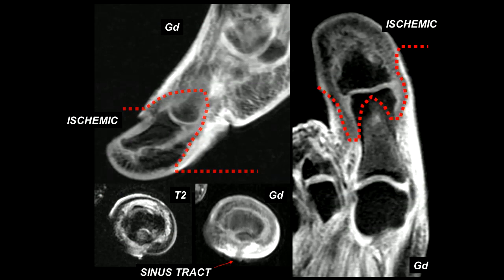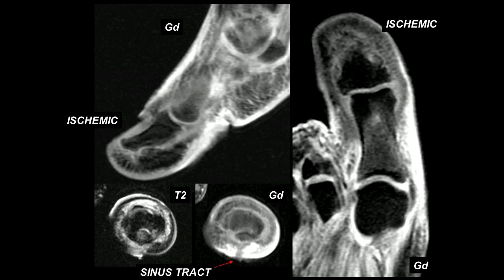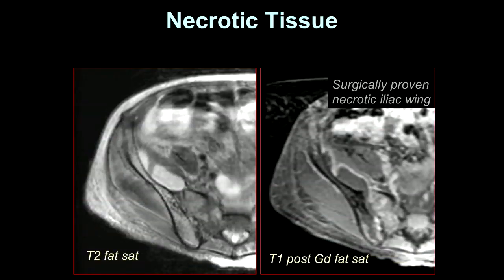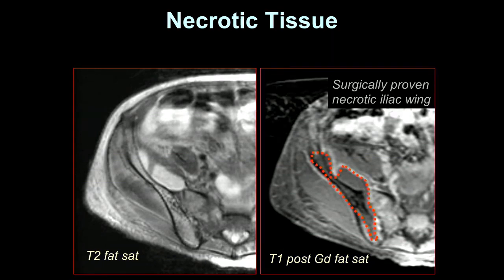Here's another example with devitalization at the great toe. We see a region of non-enhancement, and generally at the margins of the necrotic area there is a region of hyperemia with increased enhancement that helps delineate the area of necrosis. This is important for the surgeon in order to either revascularize the patient or debride that tissue. Here's a patient with an abscess at the pelvis — it's easy to see the abscess in the iliopsoas, but it's harder to see the area of necrosis unless you give contrast. T1 post-contrast shows non-enhancement involving the iliac bone, so again this is an area that will need to be debrided or revascularized.